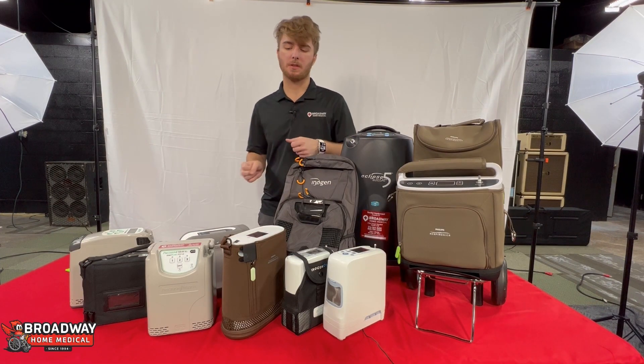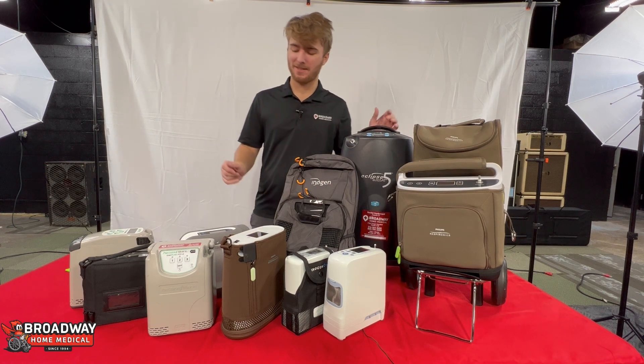Now we're going to go through some of the popular POCs on the market. We have just about all of them right now.